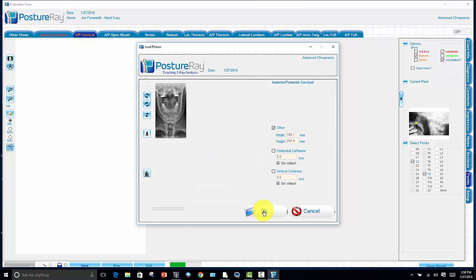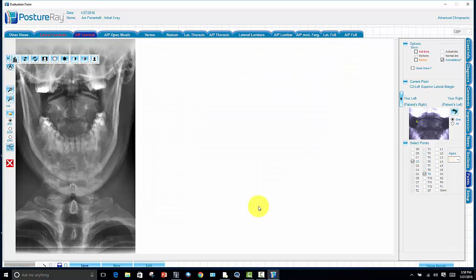Again, it matches their posture. When you look at the person's posture, you're taking photographs of the posture screen. Which way are they facing? They're facing towards you. Nothing gets more confusing to a patient, even though they're going to nod their head to you. Yes, I understand, doctor. Inside, they're shaking their head. I have no idea what the heck this doctor's talking about, especially when my head's to the right, but the x-ray shows it's to the left.